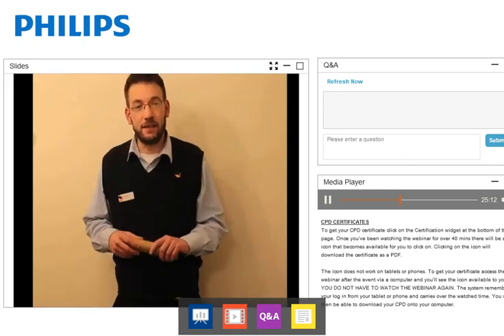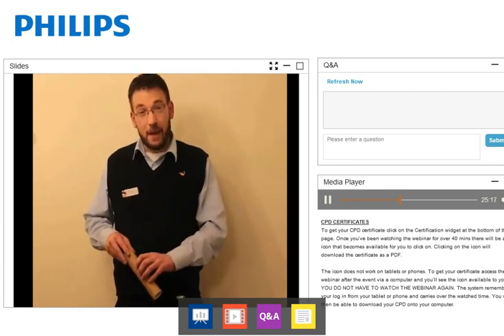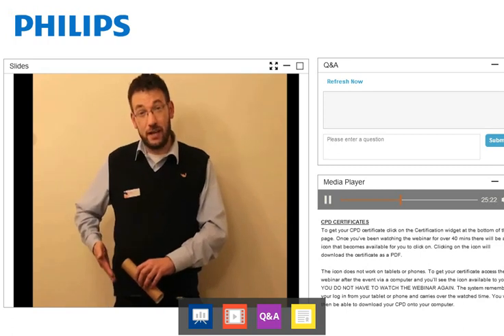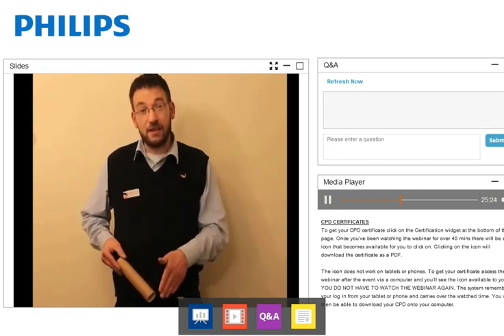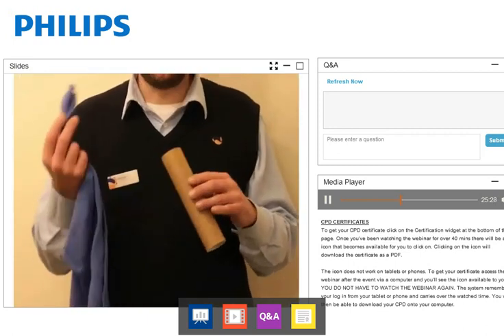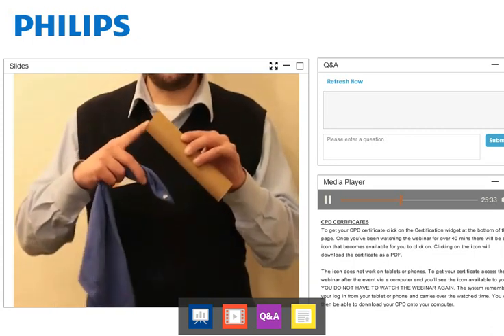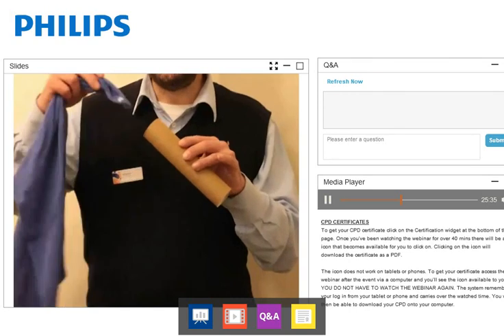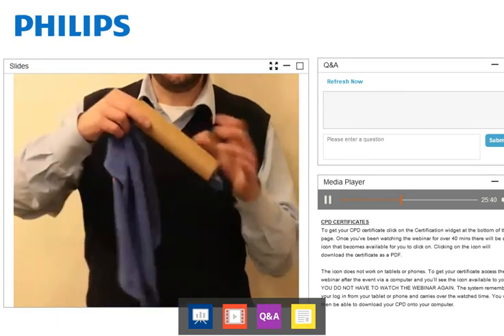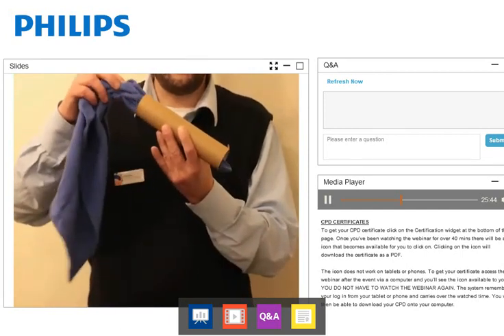It can sometimes be easy to think of the inguinal canal as a tube with two open ends. The upper end is the deep inguinal ring, and it lies lateral to the origin of the inferior epigastric artery, and the other end is the superficial ring. Now, in indirect inguinal hernia, the abdominal contents, represented by this huck towel, enters through the deep inguinal ring, the normal opening of the inguinal canal, and passes straight through the canal, goes all the way through quite easily, and comes out the other end, and that is an indirect inguinal hernia.